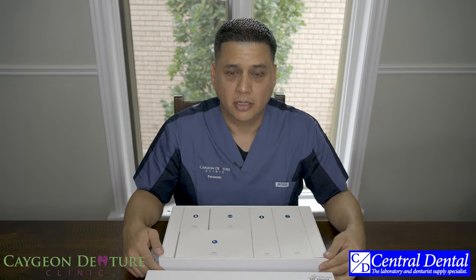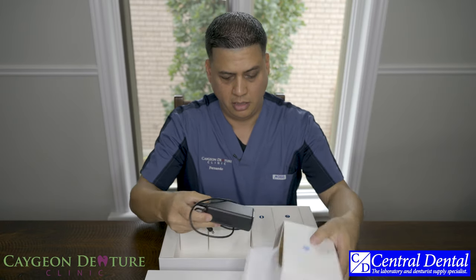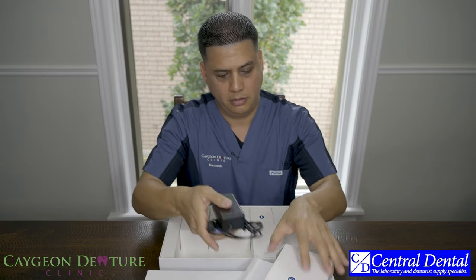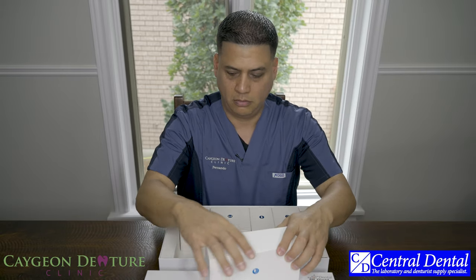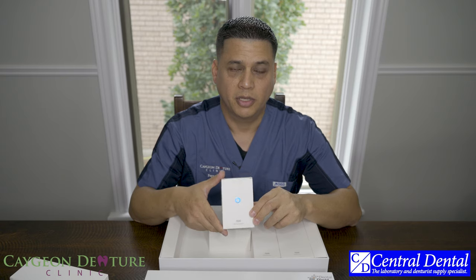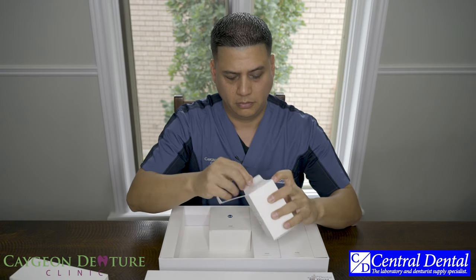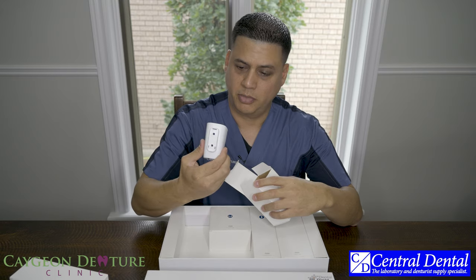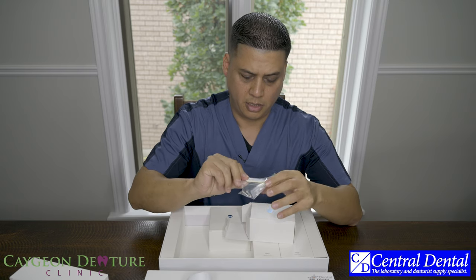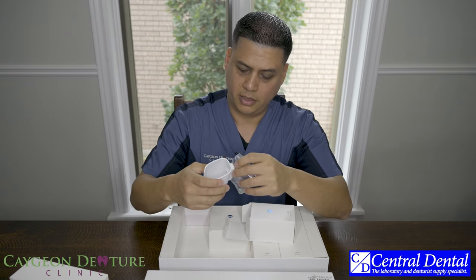There's a little bit more product in here. You will have a medical grade adapter — this is pretty much the power adapter that brings power to the scanner. There is also a wall mount, so if you decide to get a cart, you can mount the wall mount to the cart so it's easy for you to hold the scanner. It has a couple of holes in the back and comes with a couple of screws.